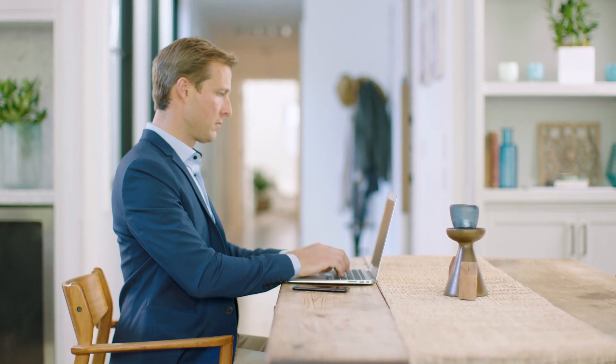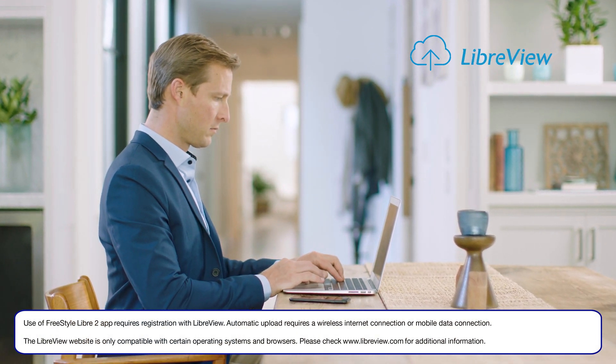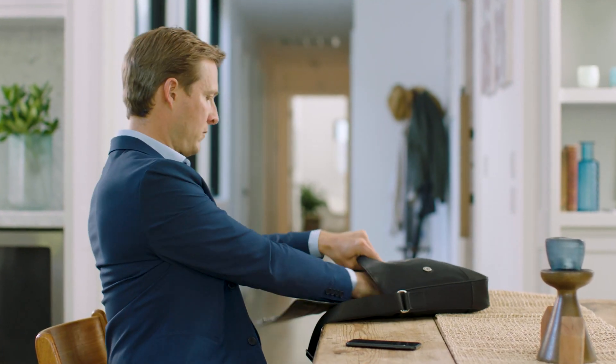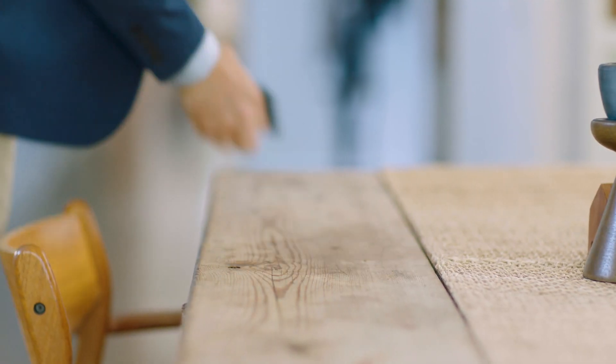Your glucose data automatically uploads from your phone into LibreView, making it easy to share your data with your diabetes management team. Turning the alarms on is an optional feature, but personally I find them to be valuable in helping me manage my diabetes.